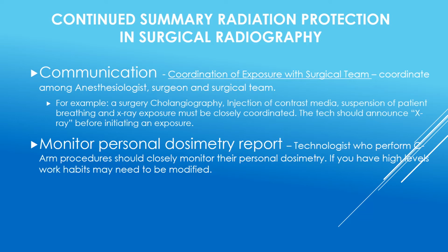Monitoring of your personnel dosimetry report. Technologists who perform C-arm procedures should closely monitor their report. If you have high levels, work habits might need to be modified.